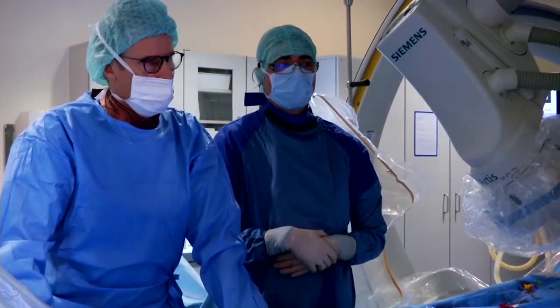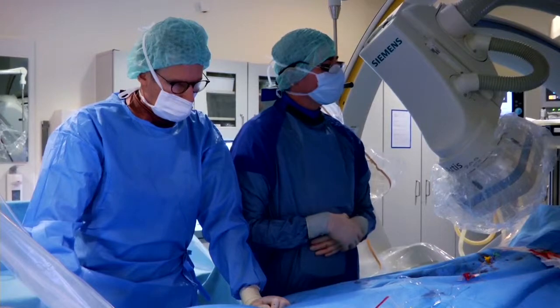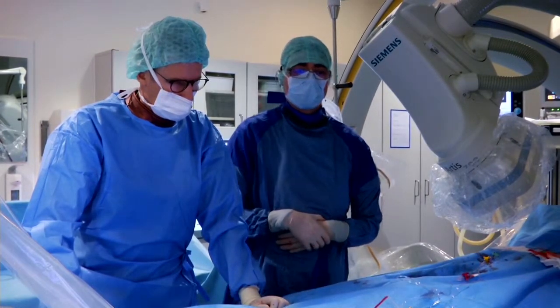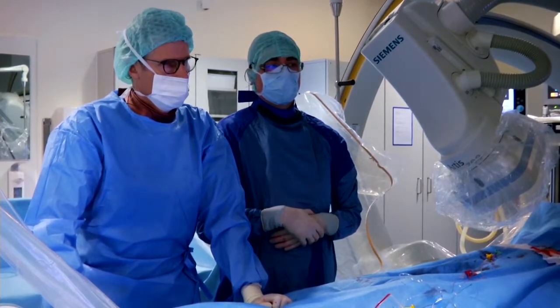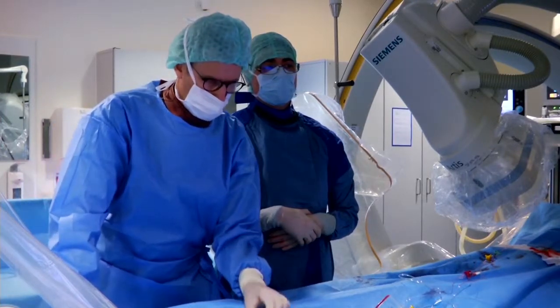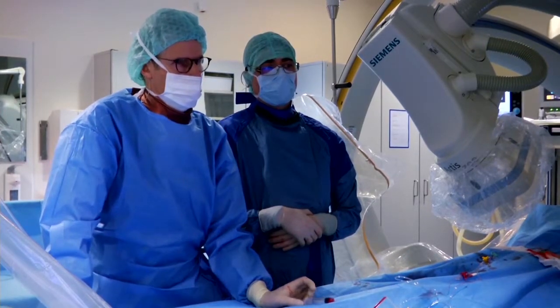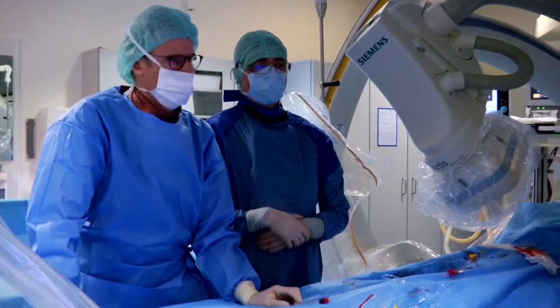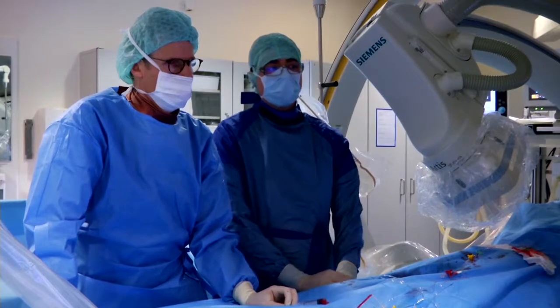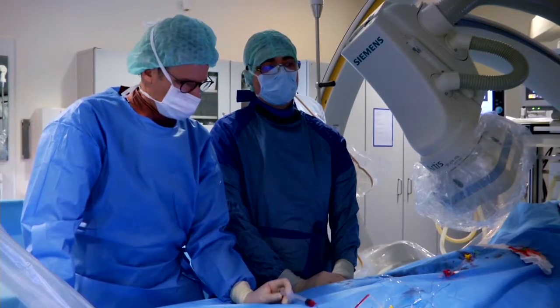Peter, this is Carlos Pedra, and I just want to ask you and the audience, in order to avoid this situation, because you don't know if you're going to be able to break this stent in the future. I'm not that familiar with the formula stent, but in order to try to avoid this very situation, we've been implanting stents in small infants through the carotid artery. And this enables us to put a stent that we can post-dilate to adult sizes, such as the 1910. So I would like to hear your opinion on that, but I totally agree with your plan right now with this patient on the table.